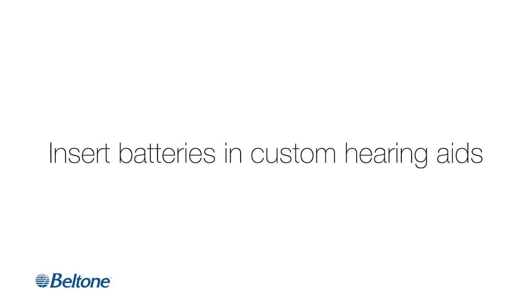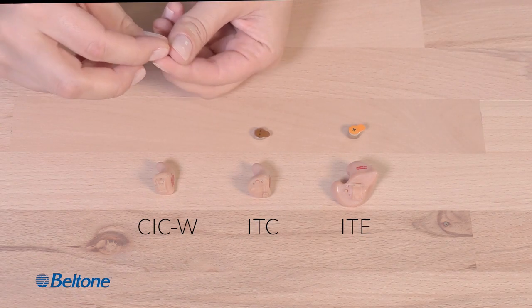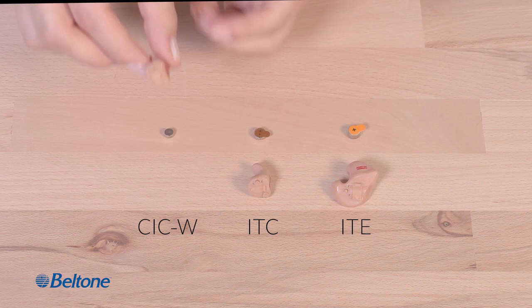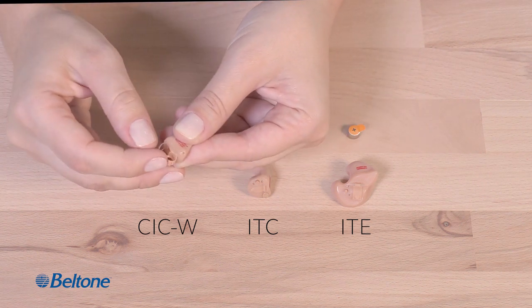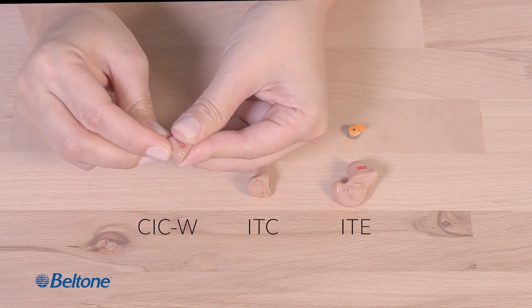Text insert: batteries 10a, 312, and 13 in hearing aids CIC/W, ITC, and ITE lie together on a light wooden surface. The user removes the backing from battery 10a and sets it on the work surface. They pick up hearing aid CIC/W, pop open the battery compartment, insert battery 10a into the open compartment tray, and then slide it closed.